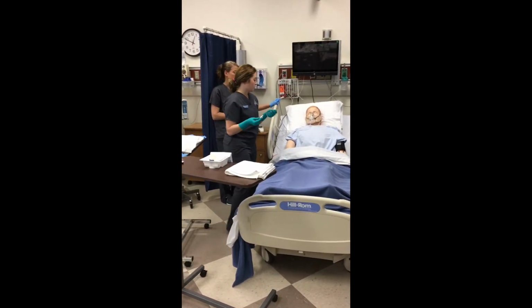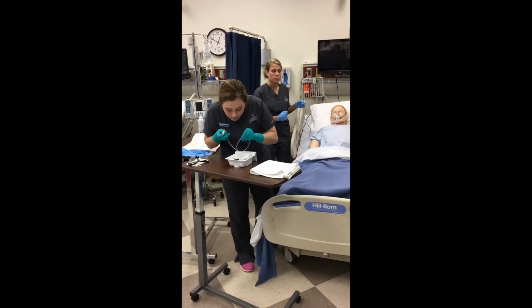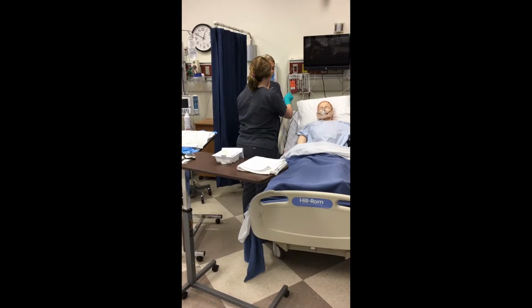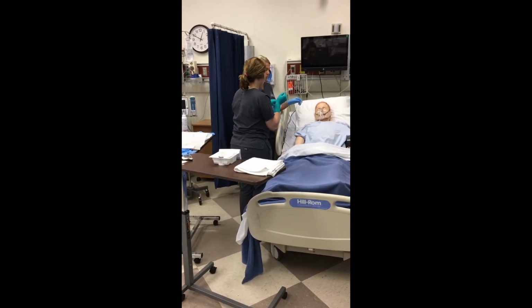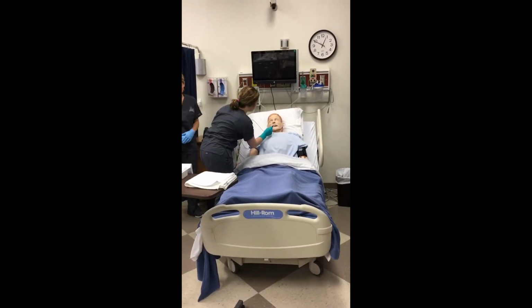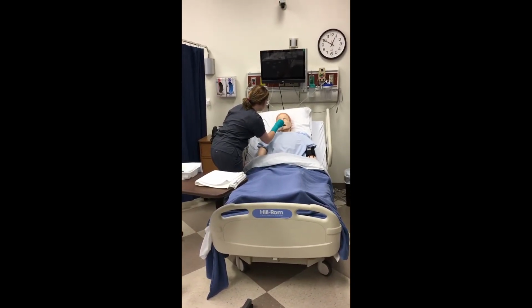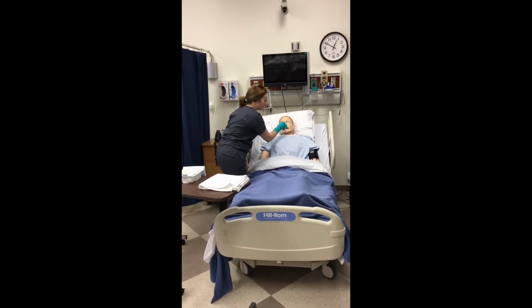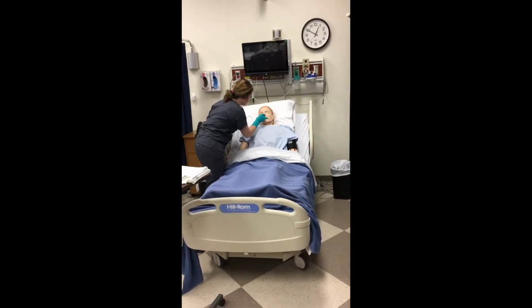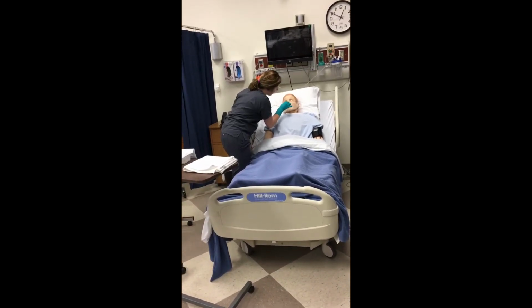So now I am going to lubricate the tip and attach it to my wall suctioning. I'm going to insert this into either nostril, it doesn't matter, along the bottom of the nasal cavity. I'm going to insert this 21 to 22 centimeters, or until I feel resistance.